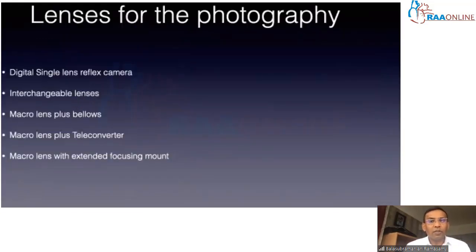So digital single lens reflex cameras have become the mainstream option for anterior segment photography in view of the high quality and easy connectivity.